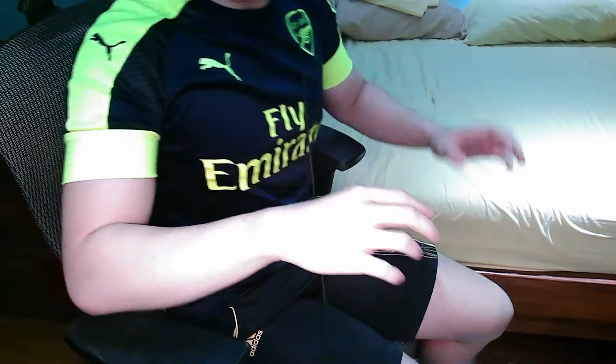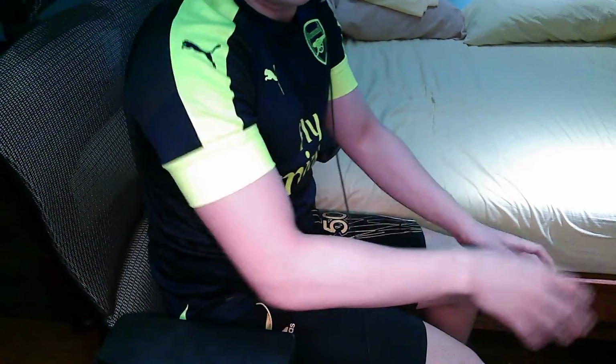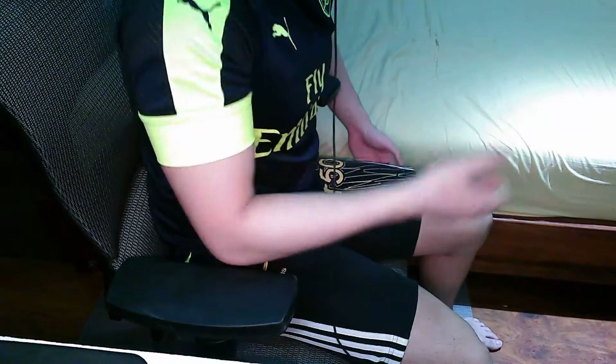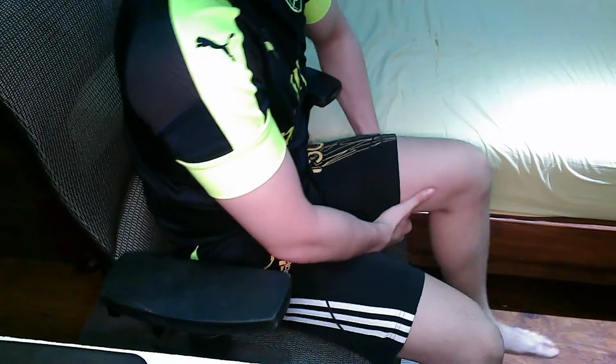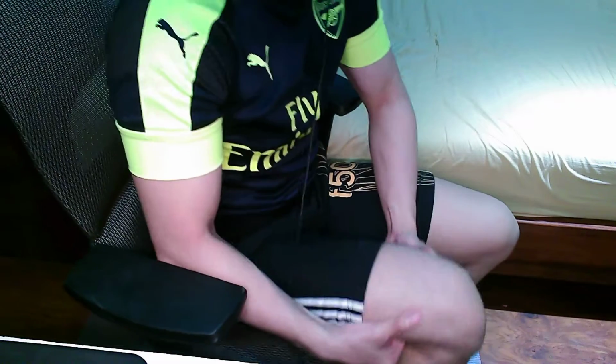Okay. So now that you're on your chair, sir, as you know, wheelchairs have footrests at the bottom. So what I want to do is adjust your legs, really grab underneath your thigh and then lift your leg up into a footrest. So that's on one leg and then on the other. Okay, sir? So that's how you get from supine into long sitting and from the bed to the wheelchair as an SCI patient.